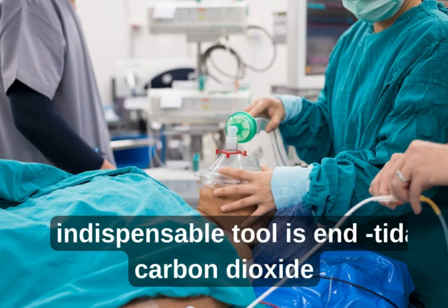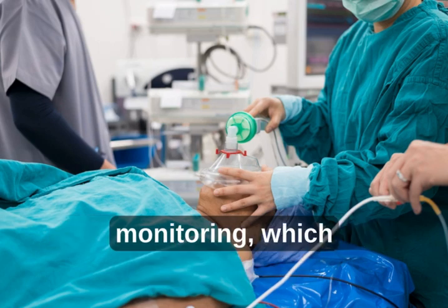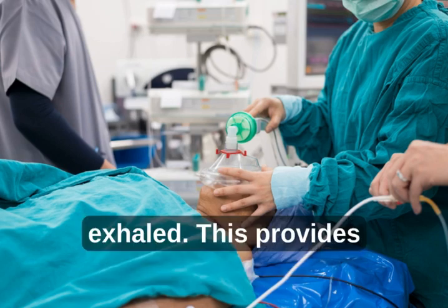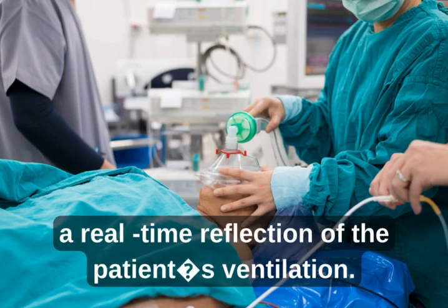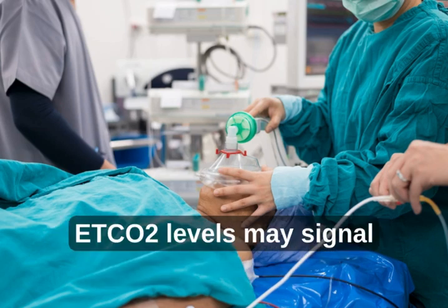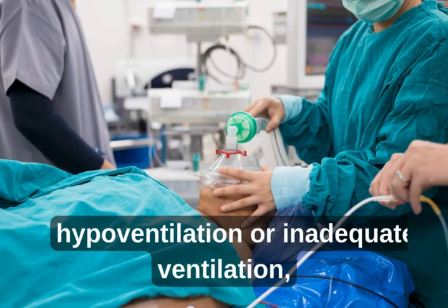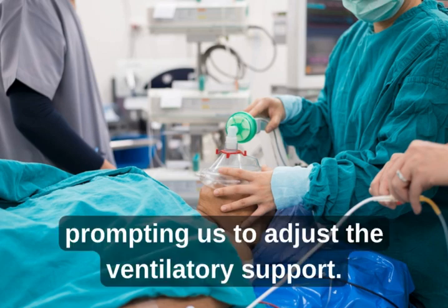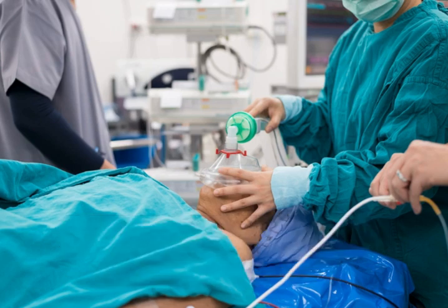Another indispensable tool is end-tidal carbon dioxide, EtCO2 monitoring, which measures the amount of carbon dioxide being exhaled. This provides a real-time reflection of the patient's ventilation. Rising EtCO2 levels may signal hypoventilation or inadequate ventilation, prompting us to adjust the ventilatory support.